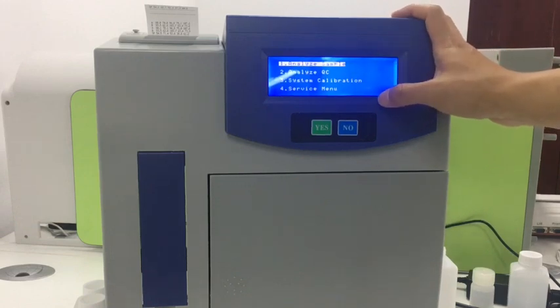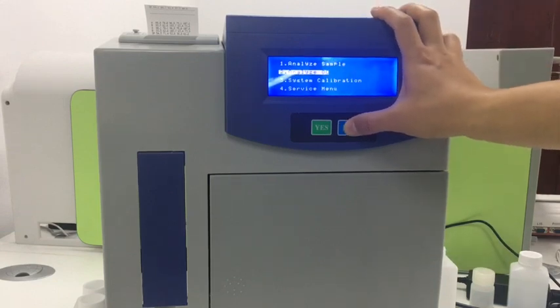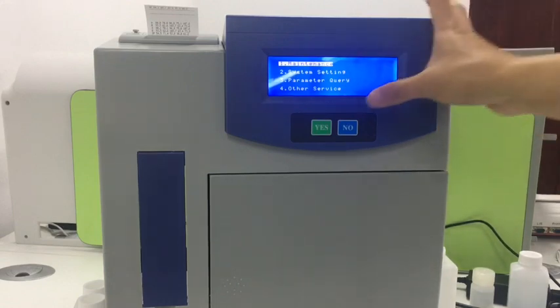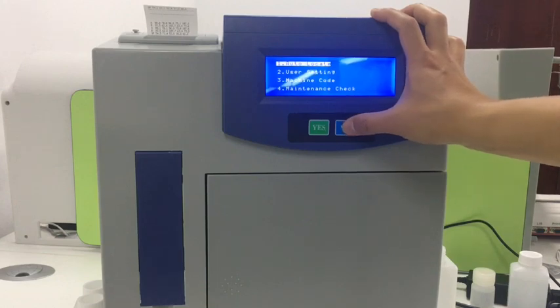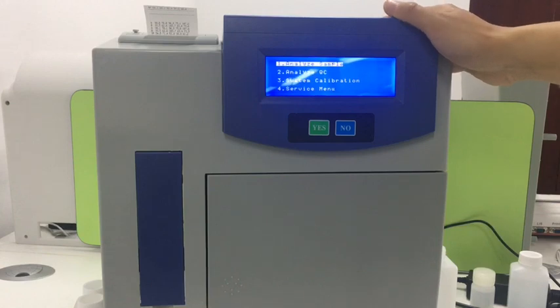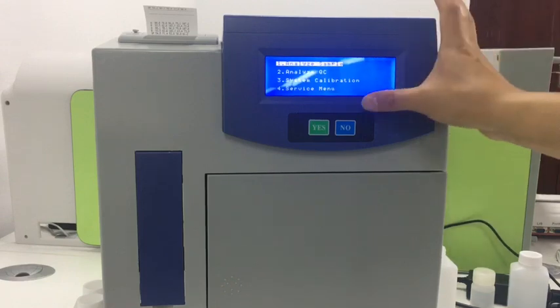Every page has four options. Press No to select — if the one shown is not what you need, press No to select others. When you press Yes, you go to the sub-menus. Let's go to the first page. This is the sample analysis — it's the first option and the one end users use most.